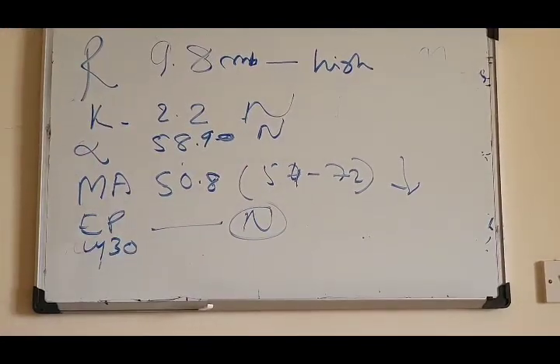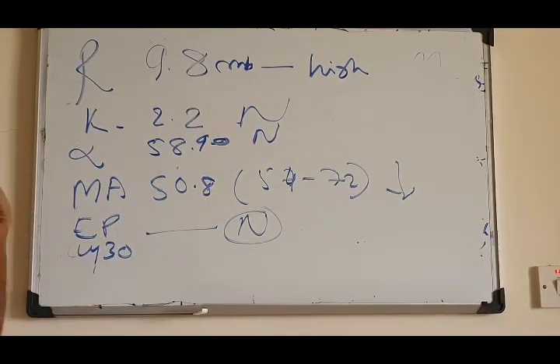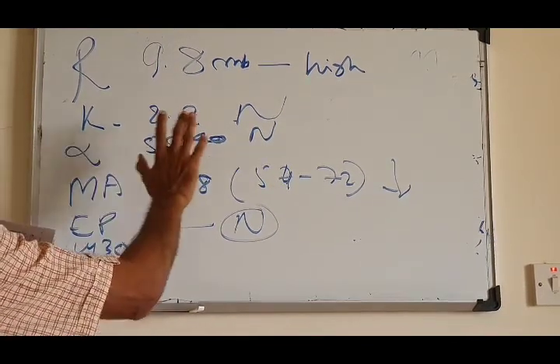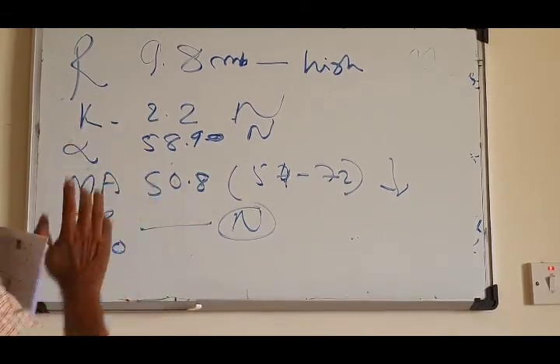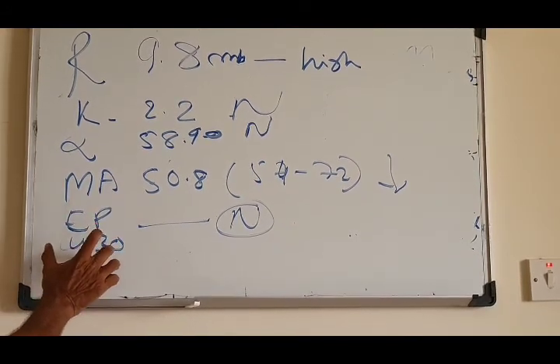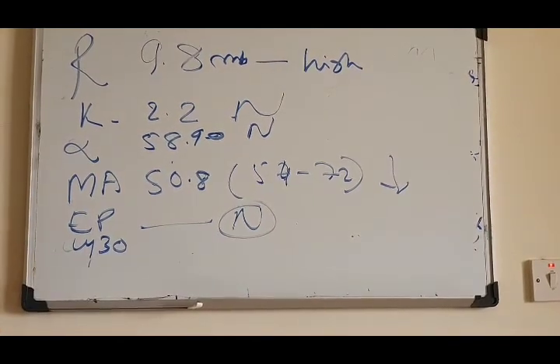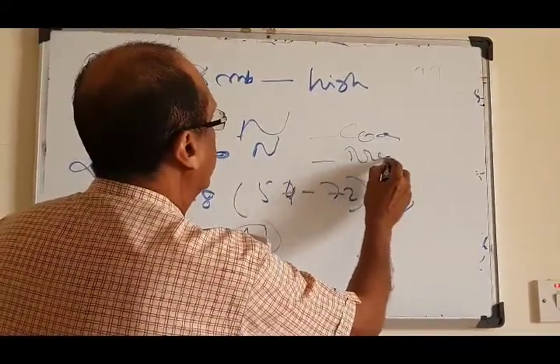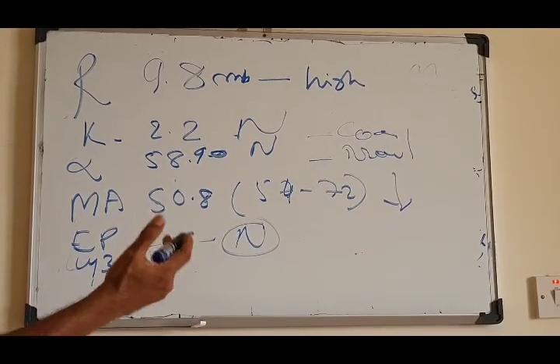So now what is your assessment? The patient here is a patient whose reaction time by TEG is prolonged. So you know there is a coagulation factor deficiency. The kinetic time and the alpha angle are normal. So the amount of fibrinogen is normal. Maximum amplitude is reduced. So there is a possibility that platelets are reduced. The estimated percentage lysis or the lysis time 30 are normal. So there is no hyperfibrinolysis. So in short, this patient has coagulation factor deficiency and thrombocytopenia. So probably it could be due to a liver disease, or it could be due to some other factors.